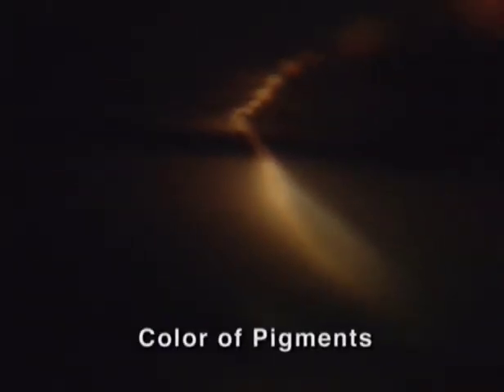The narrow light slit, furthermore, is essential for observing the correct color of pigments. Here with a wide light beam, the pigment appears black because the backlight showing it as an absorption phenomenon interferes with the direct illumination. But when separating the backlight from the direct illumination, we can now see the true red-brown color of the pigment.